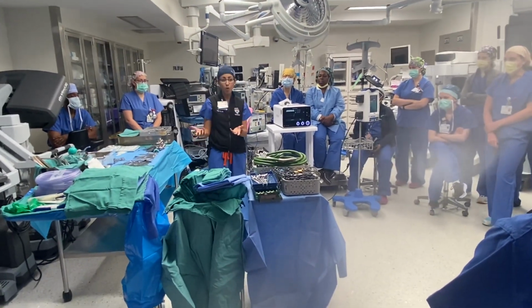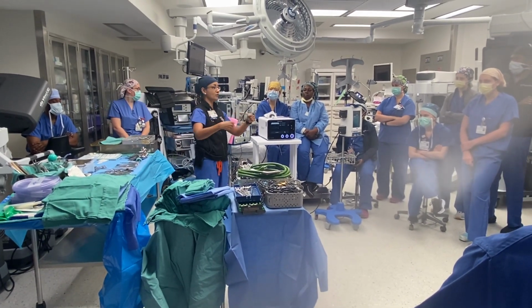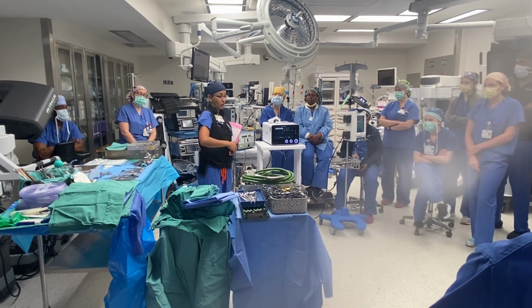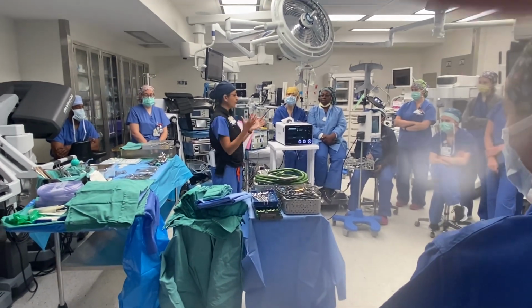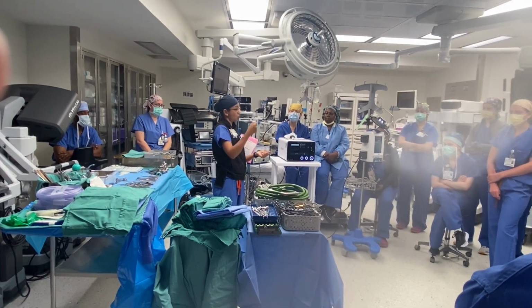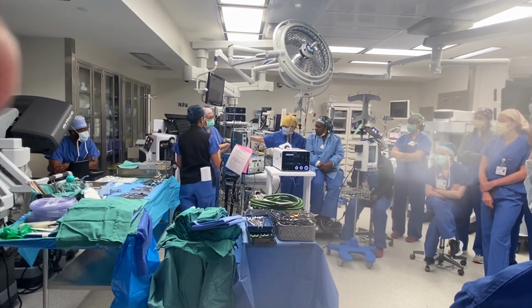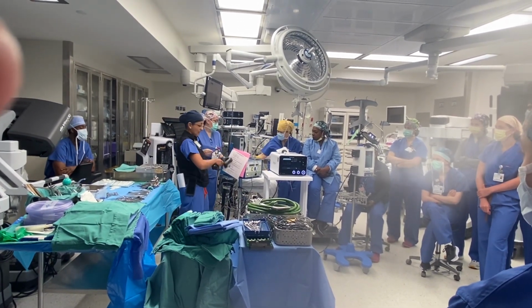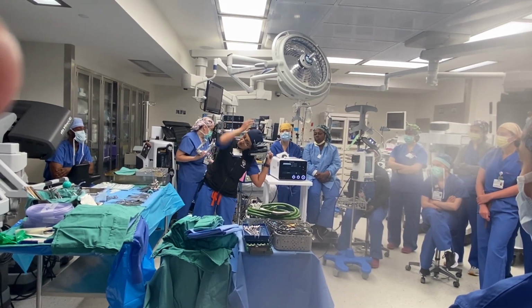Often we want a shoulder roll, which is really just two blankets rolled together and taped up, which we'll put under the shoulder typically. Then there are some differences in what we're doing at the head. Sometimes we'll use a horseshoe. This is a device that lets the head sit on it, so that we can work at the top of the head.